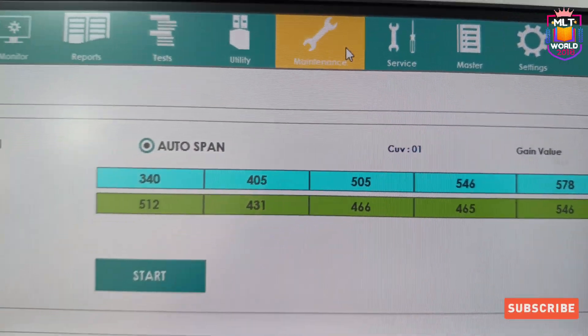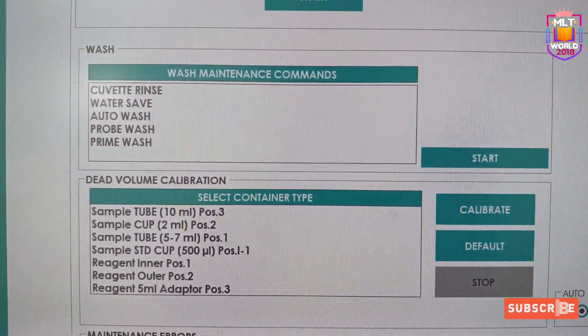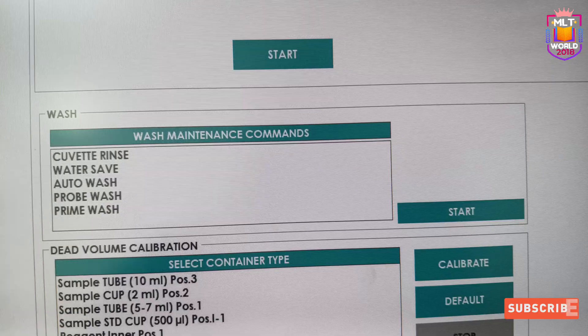Welcome back to MLT World channel. Today in this video I will show you how to perform auto wash maintenance in the Arba XL 200 Biochemistry Analyzer.